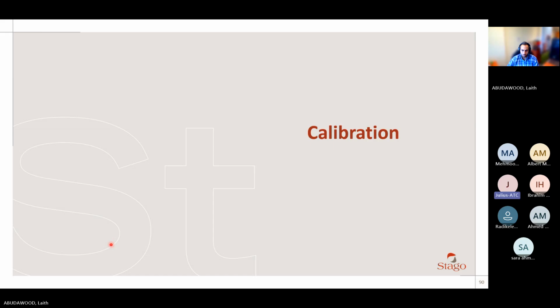Yeah, because in the LOB, I expect, for example, if the result is below the AMR, maybe some result, let's say, example only, I will give the number, example 5, but the limit is 6. So when I run this one, 5, maybe when I repeat this sample, it will be 1 or it will be 2. So this is my question, between 0 to 5. Usually what is the bias, like how many percent? At least we know an estimate, because I expect that any result which is below LOB may be 5 percent, maybe sometimes 0 or maybe sometimes 1.